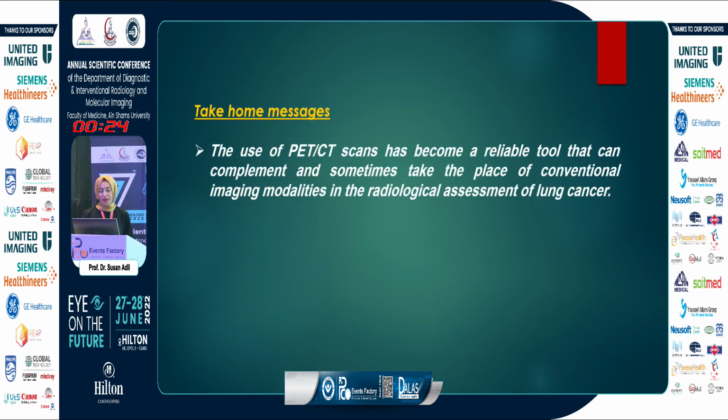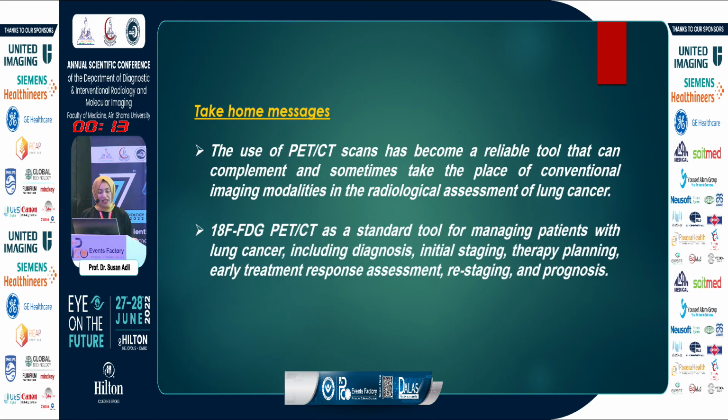To sum up, the use of PET-CT has become a reliable tool that can complement and sometimes take the place of conventional imaging modalities in radiological assessment of lung cancer. FDG is a standard tool for management of patients with lung cancer, including diagnosis, initial staging, therapy planning, and early treatment response with restaging and prognosis.